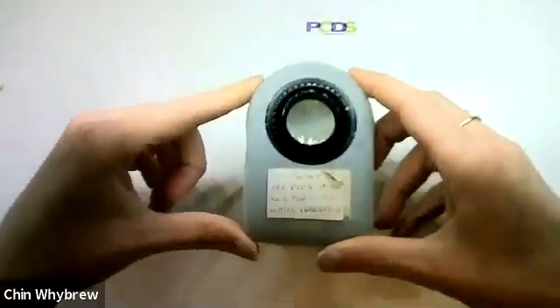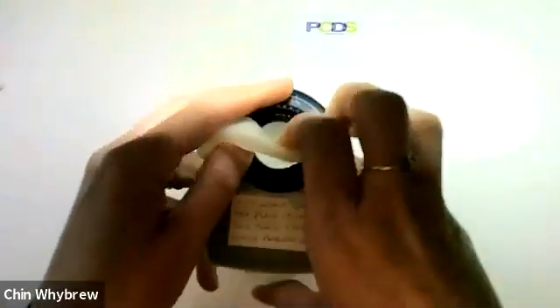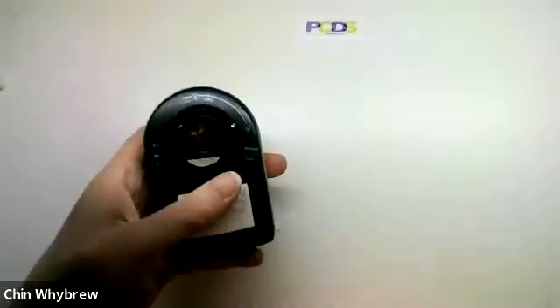Now, these ones often came with a silicon case, and what I'm going to do first of all is just take the silicon case off so that you can see what lies underneath.